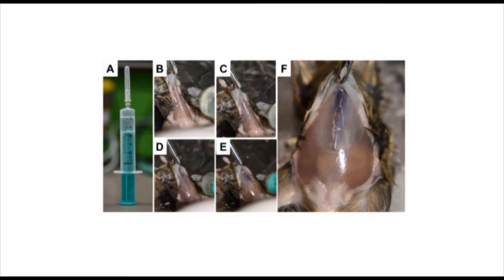To isolate the macrophages directly from the peritoneal cavity of mouse, the animal is first sacrificed by cervical dislocation and mounted on a wax tray on its back. The abdominal region is then sprayed with 70% alcohol.